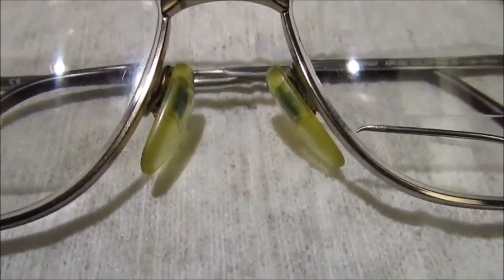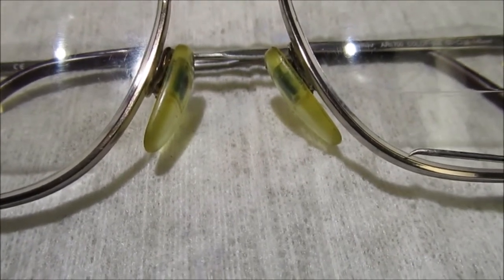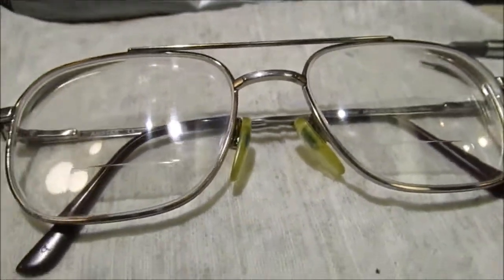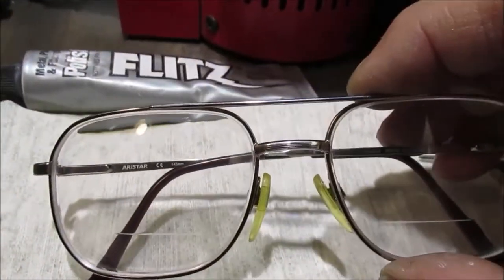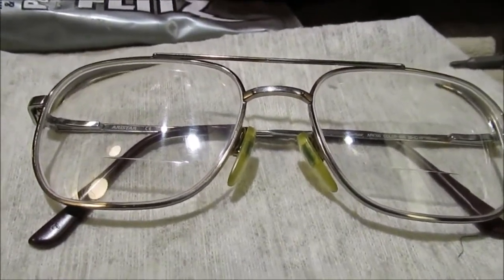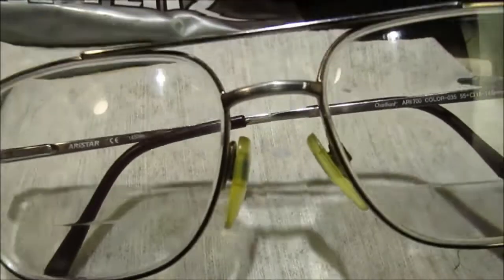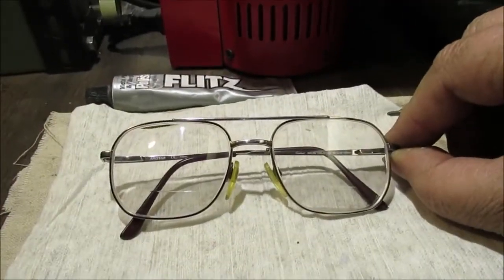I wanted to show this — I made this out of a safety pin. This was to clean the groove out in the frame, because that ridge I showed you on the lens goes in there. You need to clean all that groove out and the gunk behind there. The nose pieces get that way — they get icky looking. These frames are made in Italy and they weren't cheap frames, believe me.